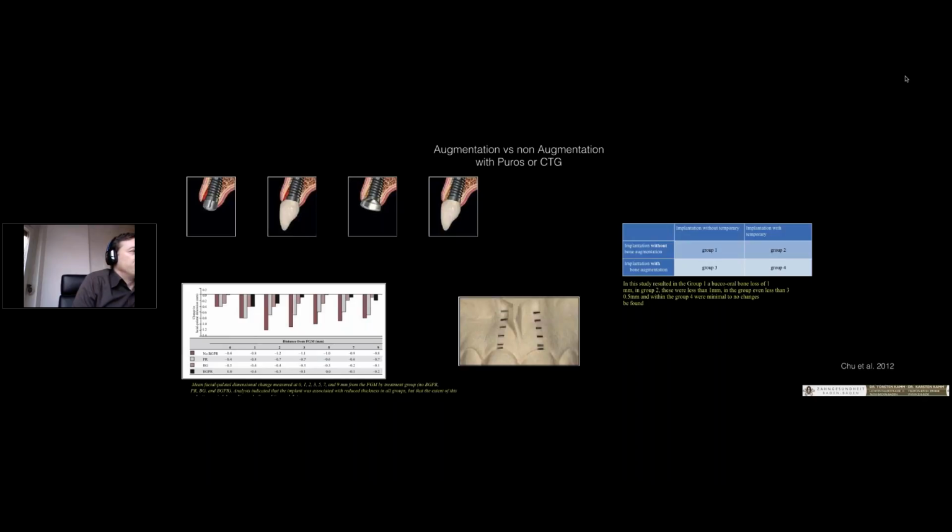And if you look at the black color, this is case 4. You see you have case 3 and case 4. You have not much bone loss. That's the reason for our new technique since the last 3 years, to make a dual zone augmentation and cover it with a screw or cover it with a crown, with a provisional crown. It's for me the best result, but it's not possible in all cases.